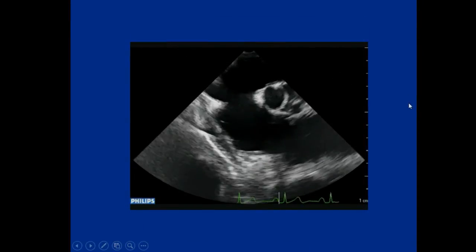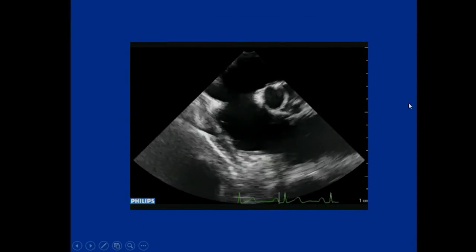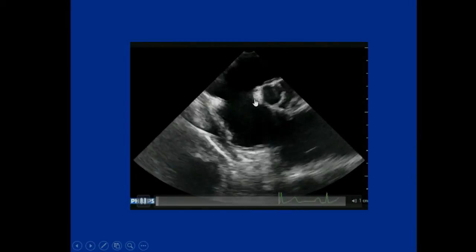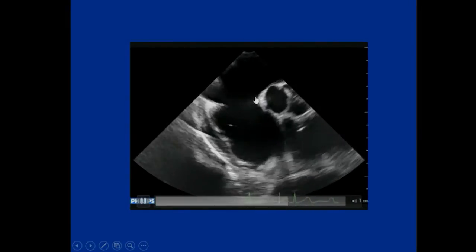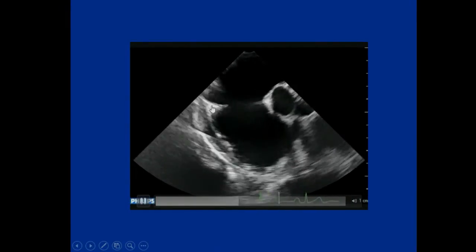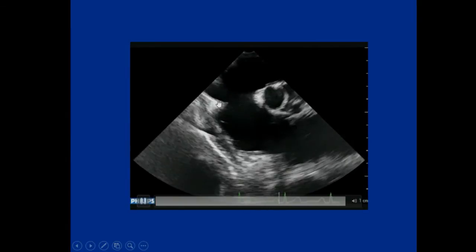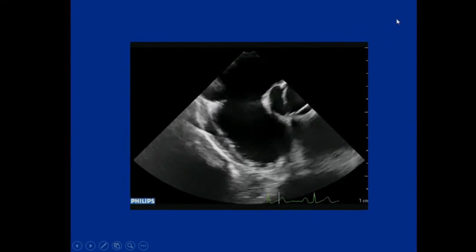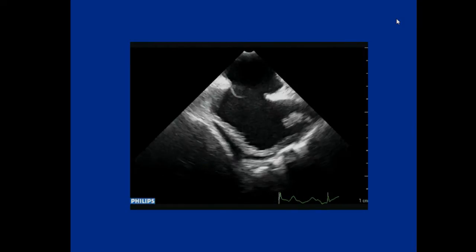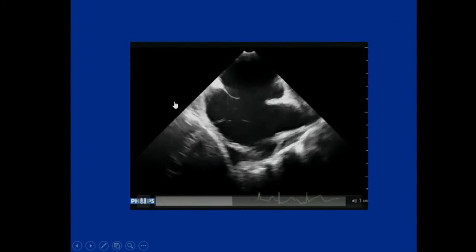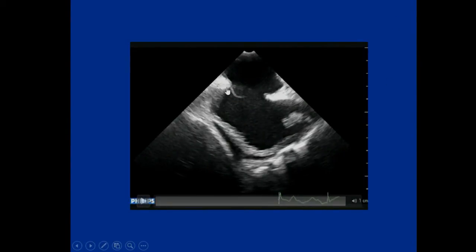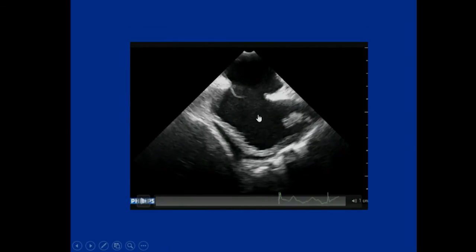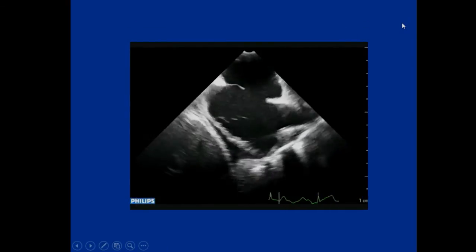This is the transesophageal echocardiography — a relatively small aortic rim. You can see a good enough posterior rim. This is a slightly floppy inferior posterior rim, but usually this is good enough for device closure.